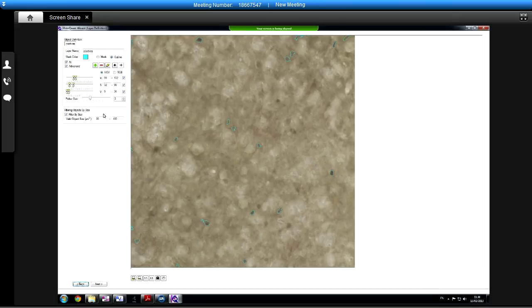So now where are we now? I think now we do seem to have these little objects start, like, is that a positive just falling off the top of the screen there, do you think? These seem to be some very small objects here, which is interesting. Well, that's generally a false positive, isn't it? Yeah. I wonder whether we could actually go up on the minimum size criteria a little bit here, because the smallest one, I think, on the other screen we measured was 48. Yeah. Well, that's got rid of some real positives, hasn't it? Because those you'd class as true, wouldn't you? I think.